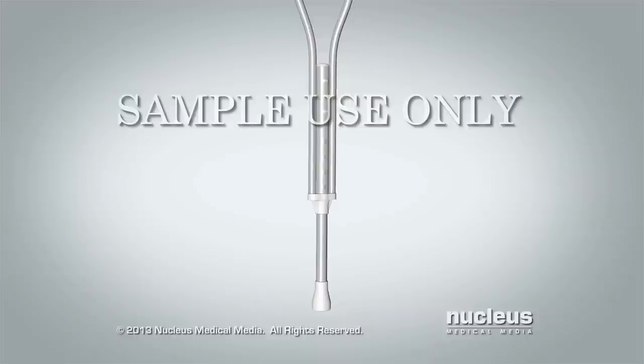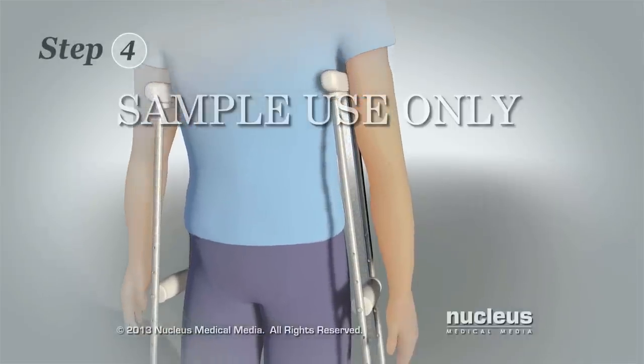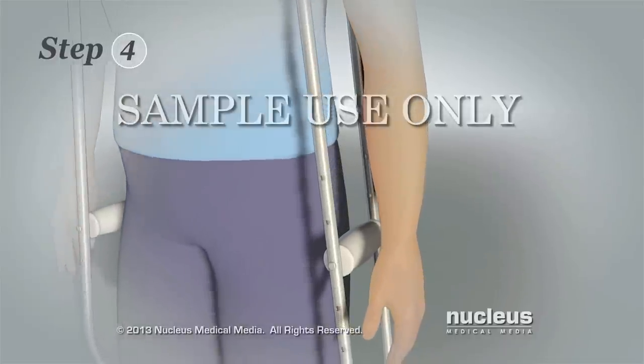If the crutches are not the right height, you can adjust them. Check the instructions that came with your crutches or contact your health care provider if you're not sure how to do this. Step 4: Check the height of the crutch hand grips.